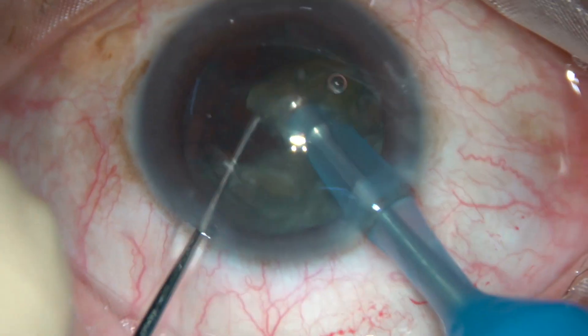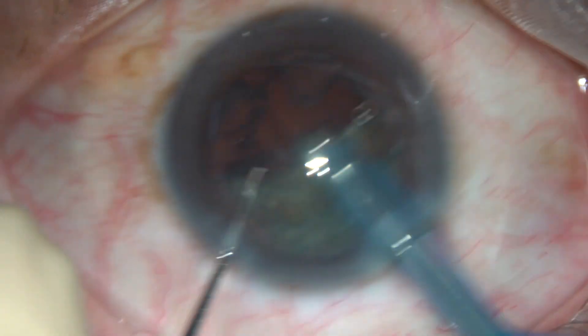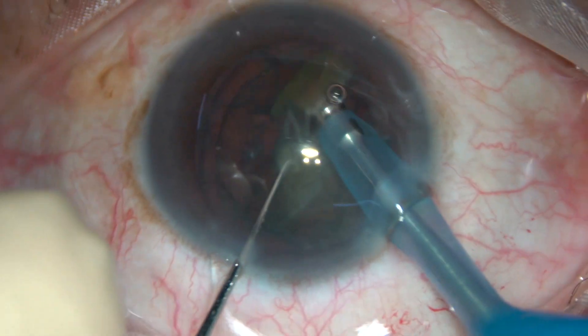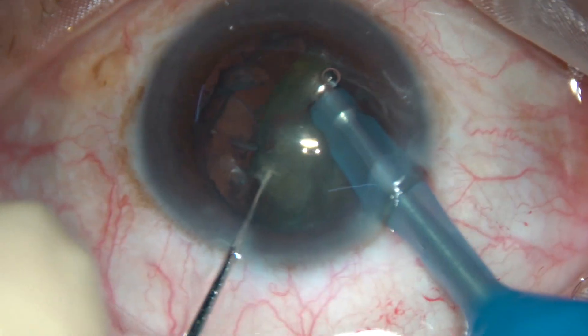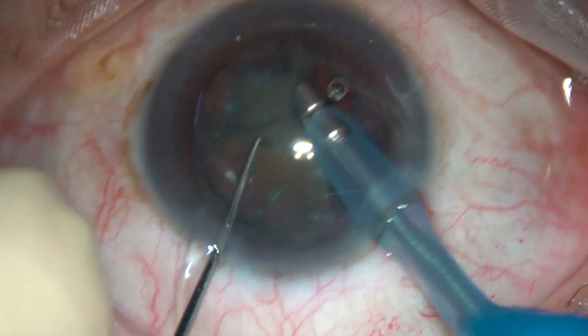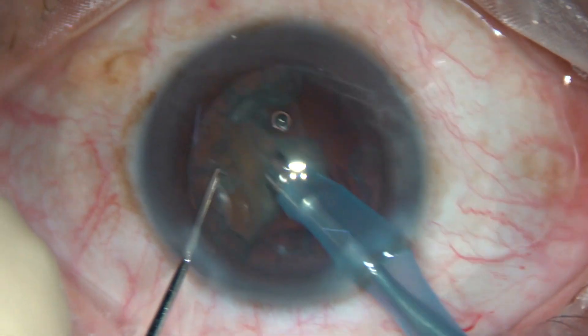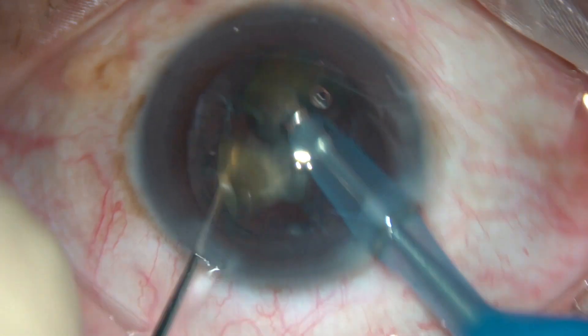Vertical chop is useful in small pupils. When you don't want to go to the periphery, you don't want to go to the zonular margin — just you want to remain at the central part of the cataract — then vertical chop is the answer.